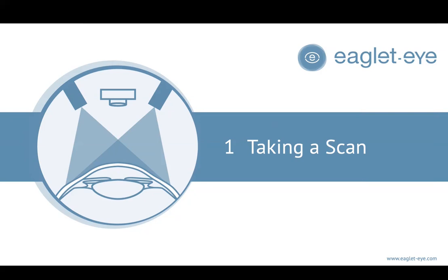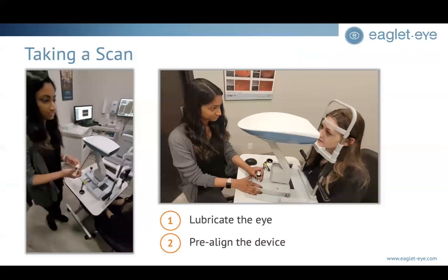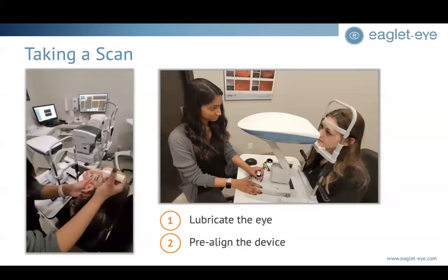And you'll find in the clinic, whether your staff are taking these measurements, or in the beginning if you're taking the measurements yourself, we always have to circle back to make sure that we're following the appropriate protocols. And I'll just share with you a little bit about what that is.